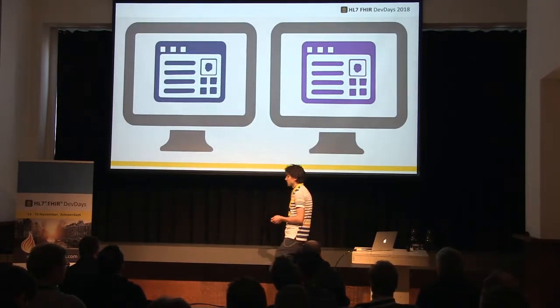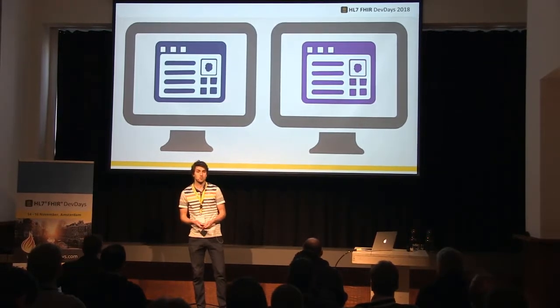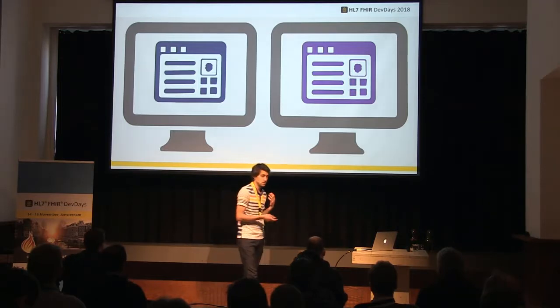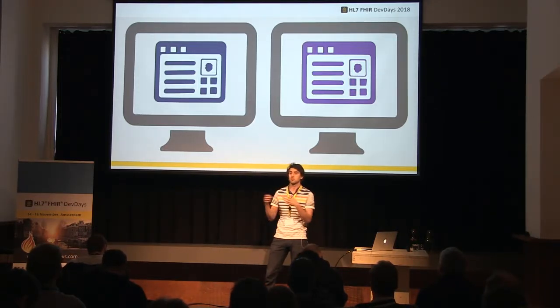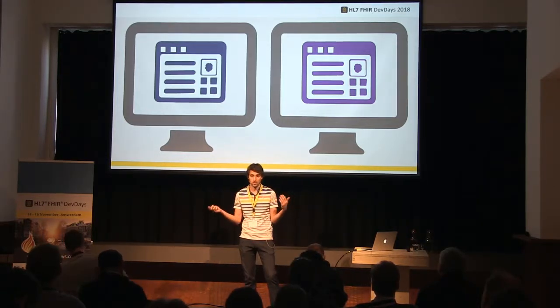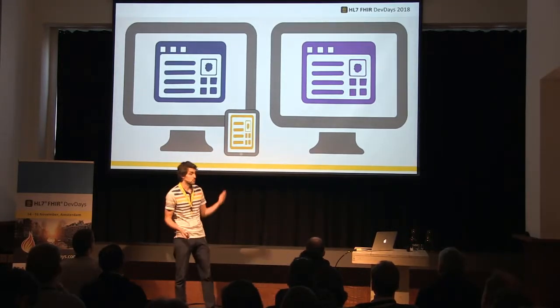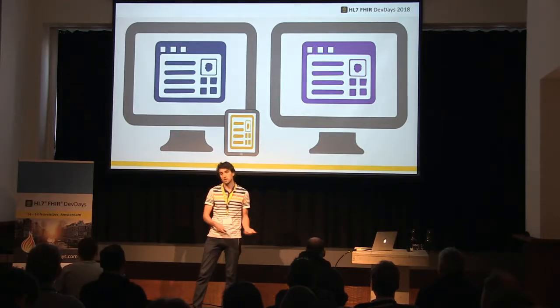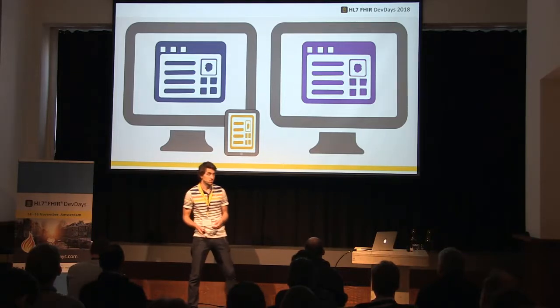A little bit more complex situation might look like this. These are not two displays, these are two computers. This is not very common today, but it isn't very far-fetched if you think about it, that you have custom workstations doing custom work, and you have applications on them, and you need them to synchronize. If you look at this situation, it's even more obvious that this will be the future. You have workstations, and tablets, and mobile devices, and you want them all to work in some kind of the same context.